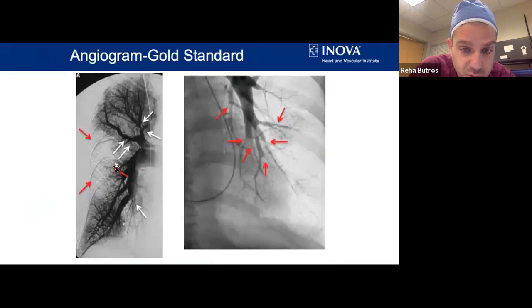This is an angiogram showing a variety of lesions. You see a subtotal occlusion here in the right middle lobe, and you see the wedge-shaped defect. So there's a big perfusion defect. This is a more delayed parenchymal phase, and you should see the parenchyma as you see in the upper lobe and the lower lobe, but we don't see that. You also don't see the medial aspect of the right lower lobe, and those are big perfusion defects. And here you can see the ring lesions, the web lesions, and total occlusion. So you can see all of these lesions in a single angiogram.